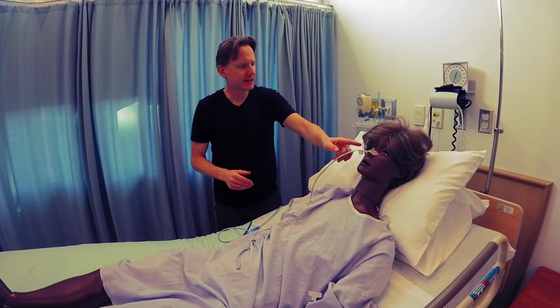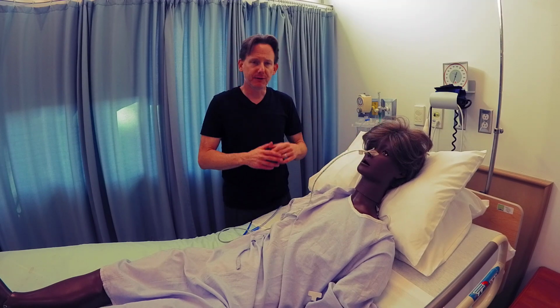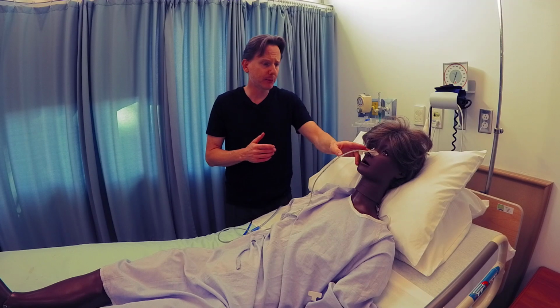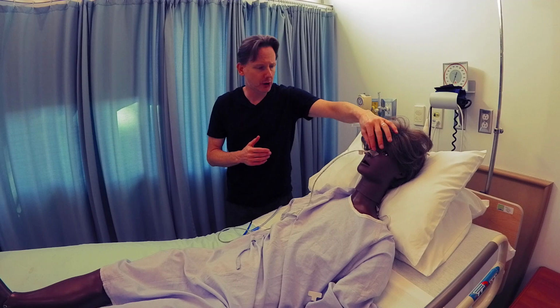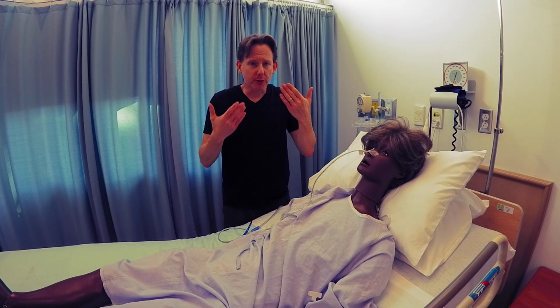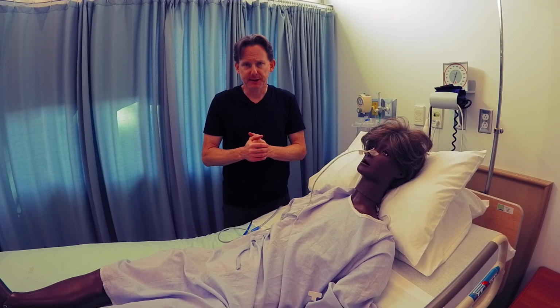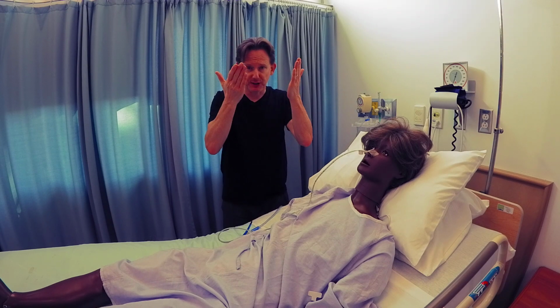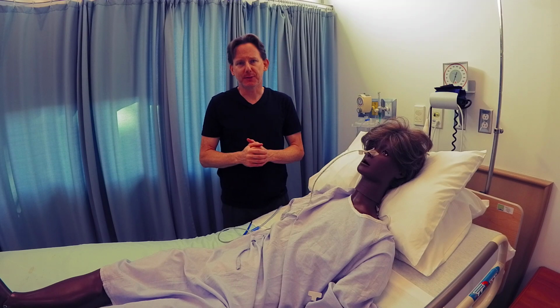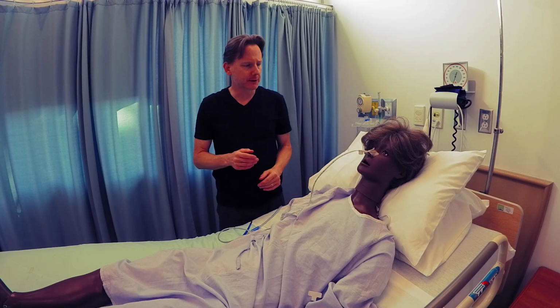Start with the nose. Is it taped to the nose properly? If it's not, we need to fix that. I recommend using skin prep whenever you apply one of these nose dressings, because it stays in a lot longer through patient diaphoresis. So when they sweat, these dressings come right off and the tube falls out. So please take the time to use the skin prep, and it'll stick a lot better.